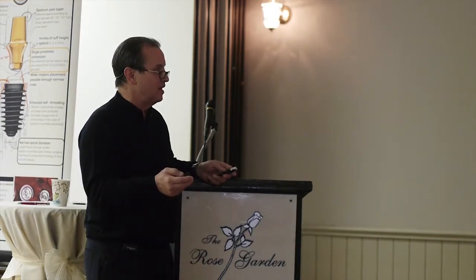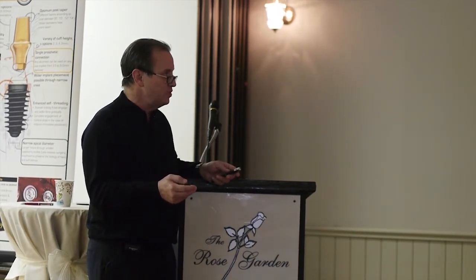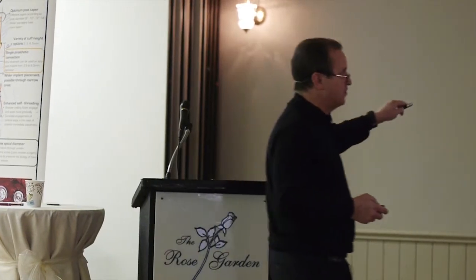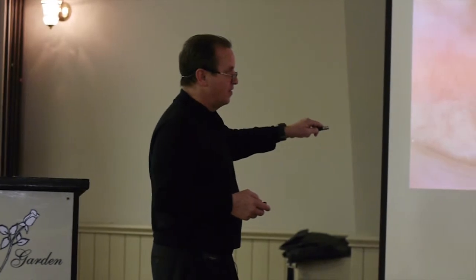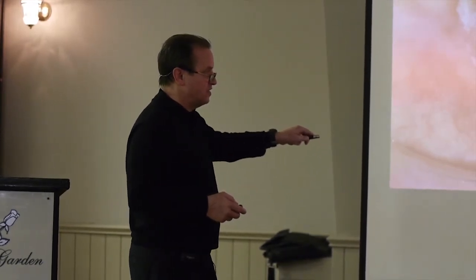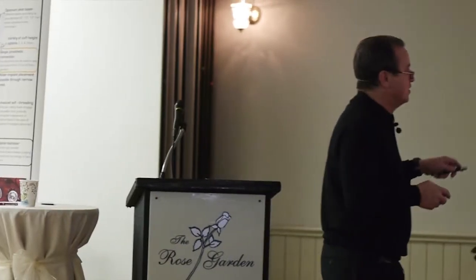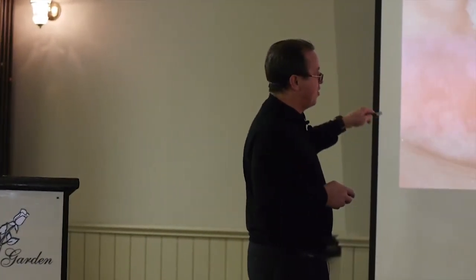So the thing I was looking at is what she's got. I made her some new dentures. But what she's got is this framework down here that's made to match to these two prong things. So we can't make her another framework. We can't get the parts. We called all over this. Couldn't get the parts. So what we did was we took the bar out of her mouth.